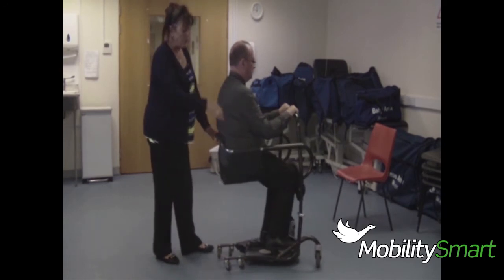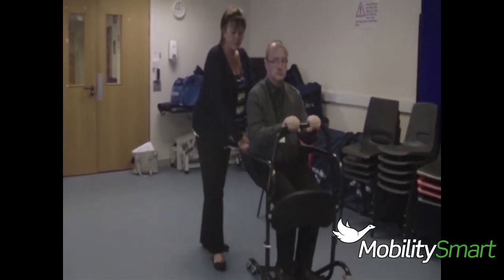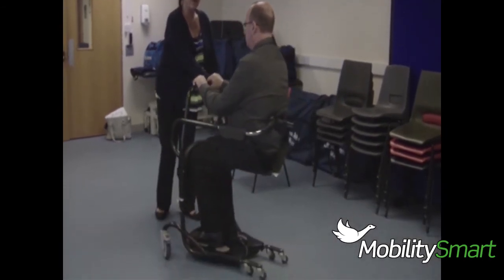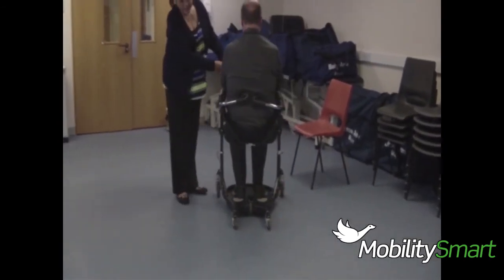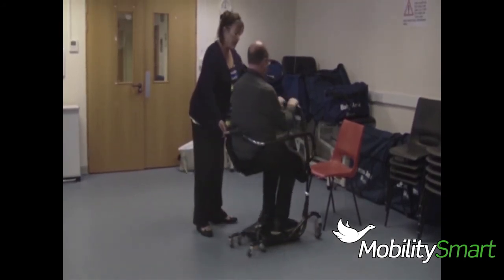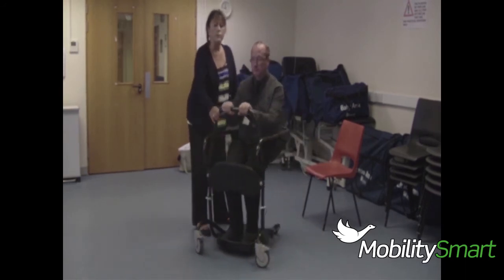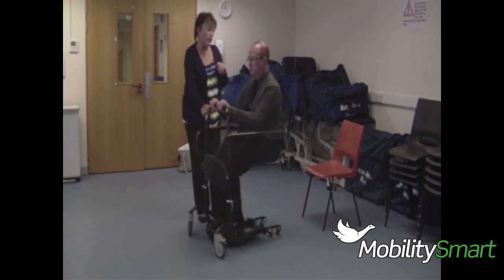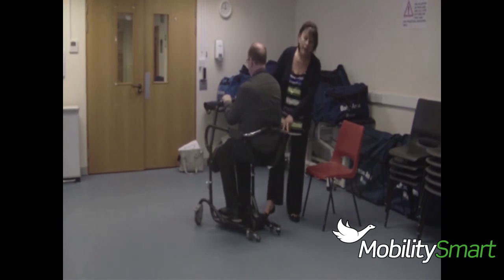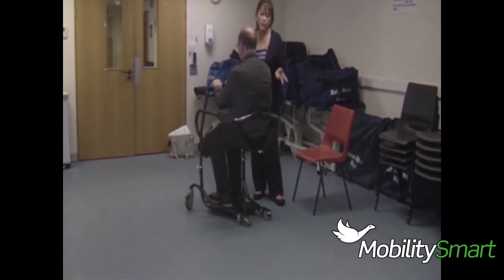So as I say, you can either pull from the front so that you've got the eye contact with the client, or you can push from the back. Because it has that fifth wheel underneath the foot plate, which is just here, that's what enables it to turn right within its own space. So when you're working in a confined space like bathrooms, small rooms, etc., this works very well. Now at the back here, this is designed to go around the pedestal of a toilet. So you can now transfer somebody directly onto the loo.